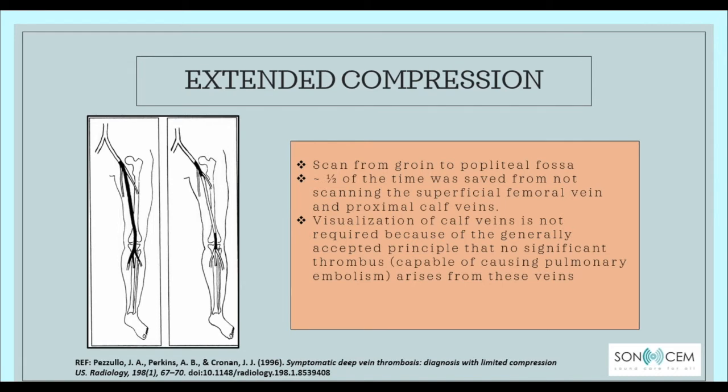While in extended compression, we scan from groin to popliteal fossa. Half of the time is saved because the visualization of calf vein is not required, as there is no significant thrombus that may arise from these veins.